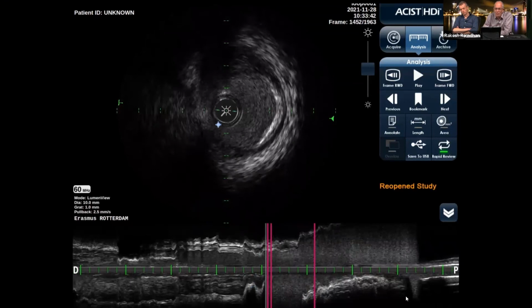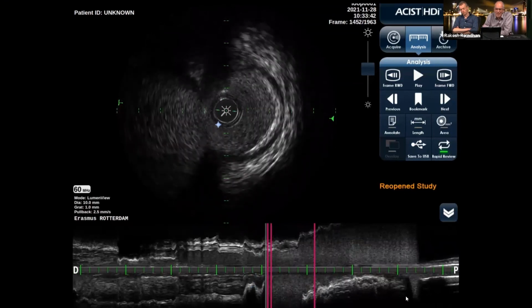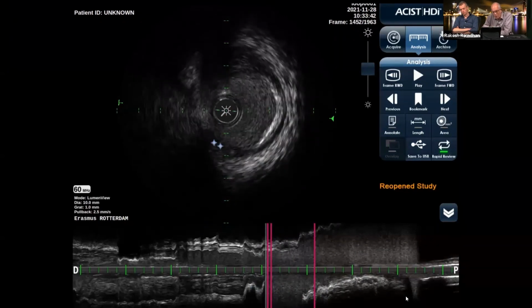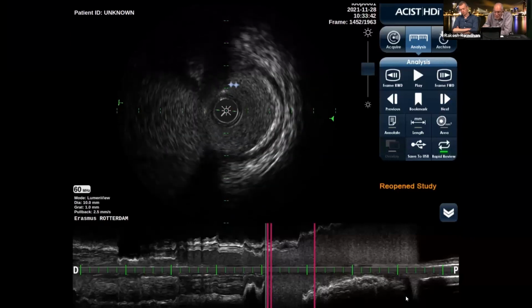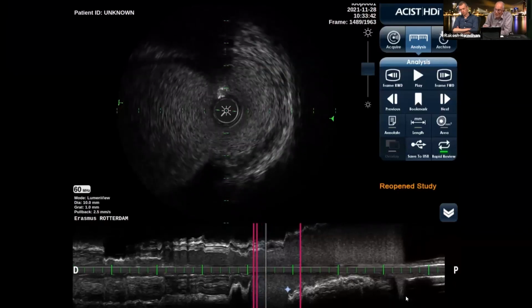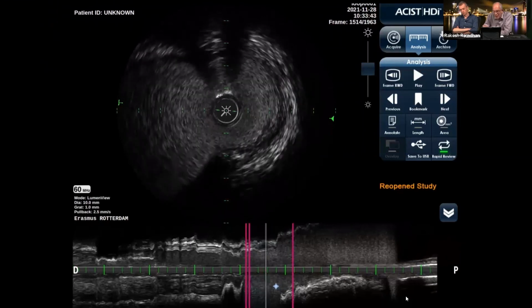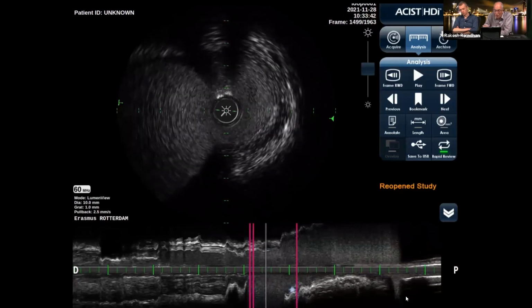And if I remember the angiogram, the middle angiogram before, then I saw that the guiding catheter was quite deep and hitting the flow divider of the bifurcation. But nevertheless, I cannot see really an opening in there. So we kept it in the middle, spontaneous dissection, rare, but also possible iatrogenic because of the guiding bumping against the flow divider. But nevertheless, we have to deal with it.